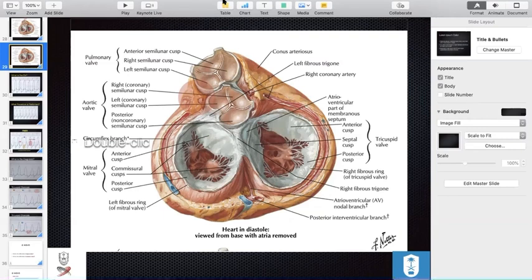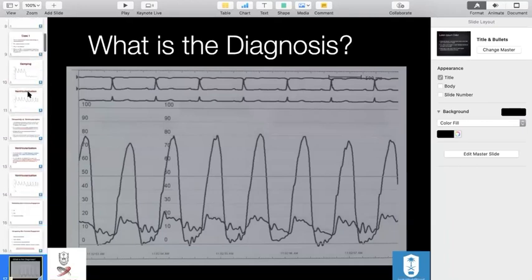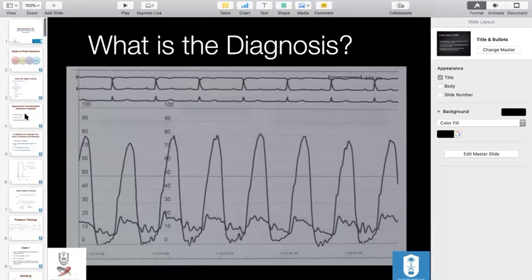So the right ventricle, left ventricle is not important, but you can tell from the numbers here. You see how the numbers here? If you see low numbers, usually, most of the time, it is a right-sided chamber. It's not always the case, but it doesn't matter if right or left. I will tell you. Most of the time, we tell you if you know where you are, in the left system or in the right system when you do your hemodynamics. But that's not an important step. I never put it as an approach here.